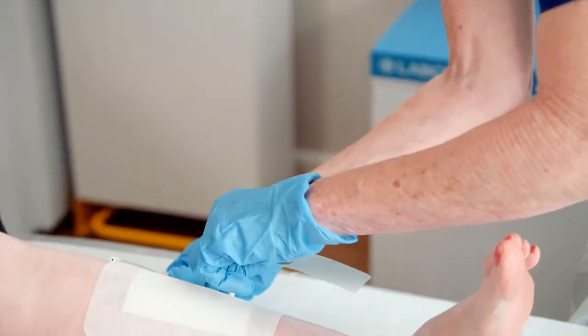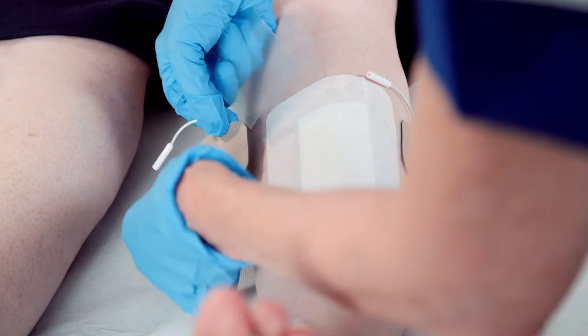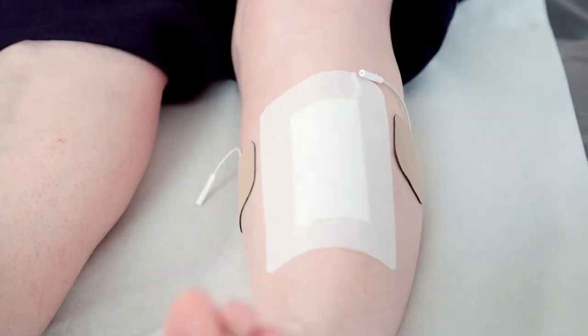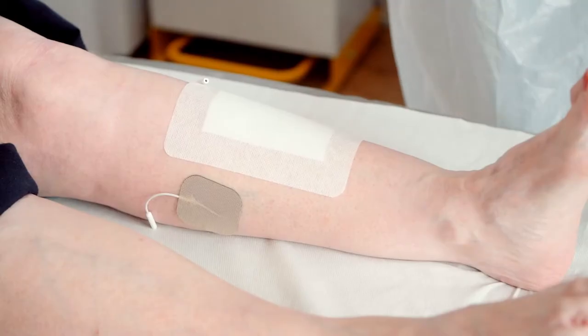Apply the Axel Heal pads as close as possible to the wound site on healthy skin, either side of the wound, but ensure the pads are applied away from the area covered with the primary dressing.